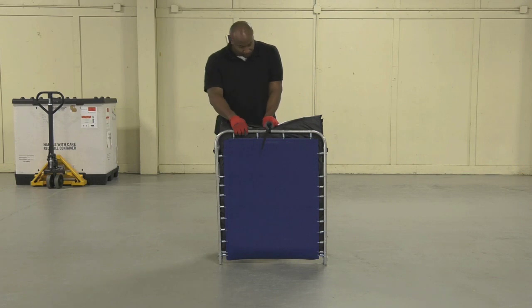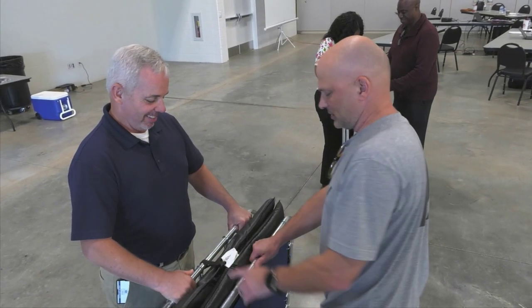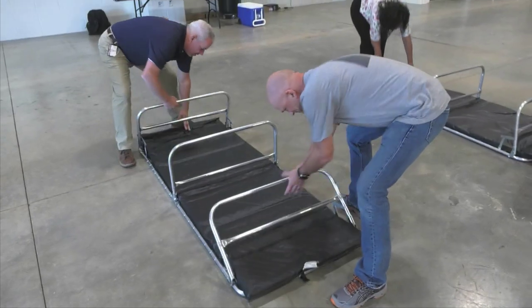To assemble the bed, first unlock the clip located near the top of the frame and open the bed. Lay the bed face down and raise all three legs so they're pointing upward.